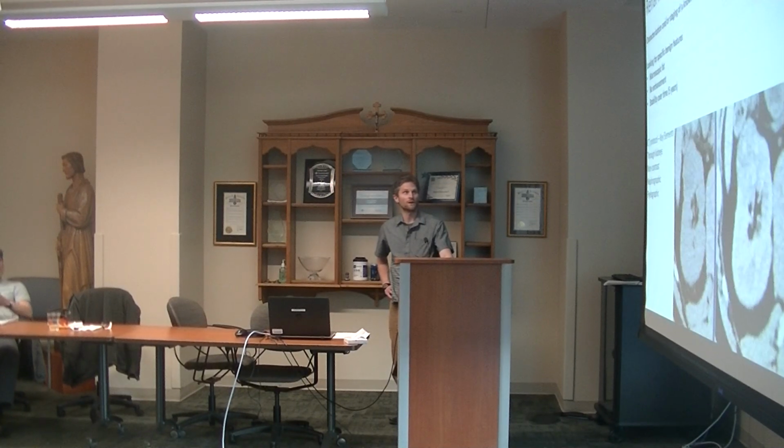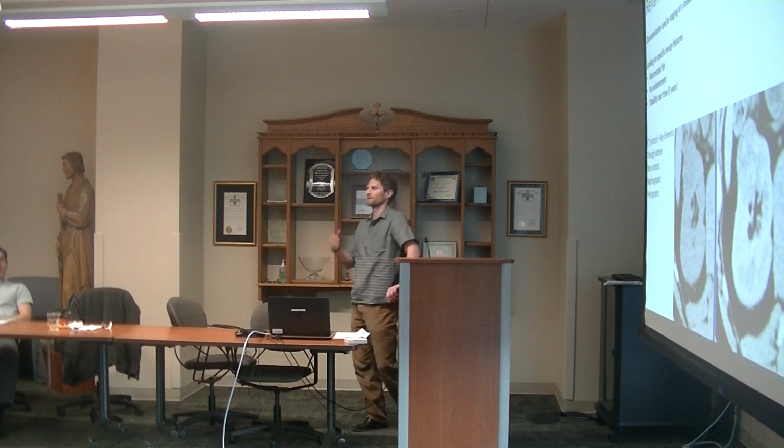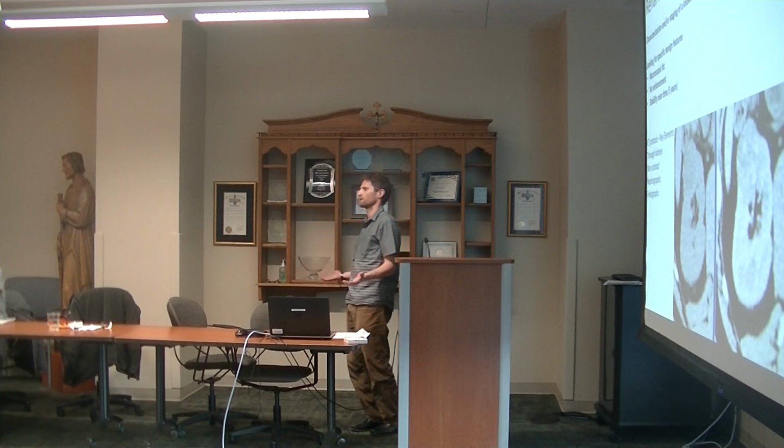On to some body cases. I wanted to go over these. These are some of our specialized abdomen protocols. I'll preface this by saying that these exams are not the routine abdomen pelvis. These are tailored exams for a specific question.